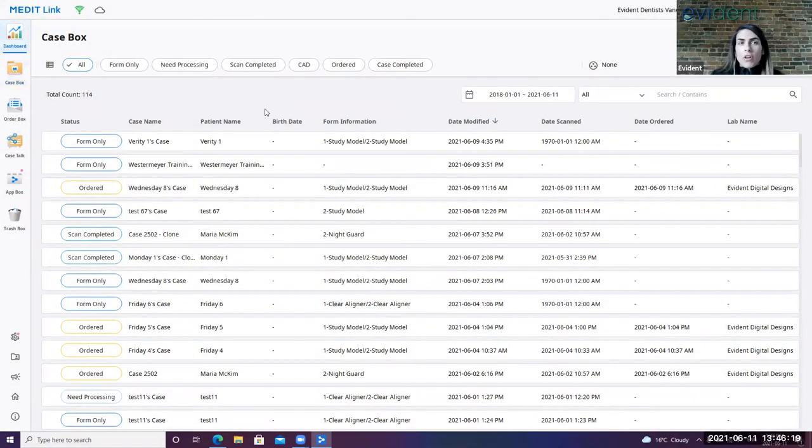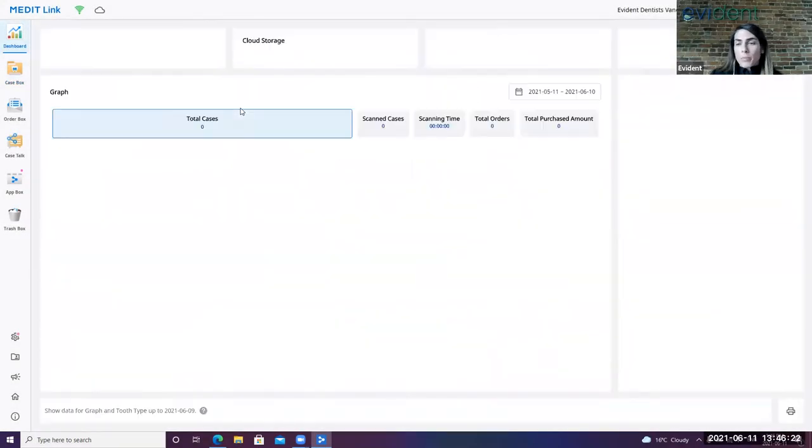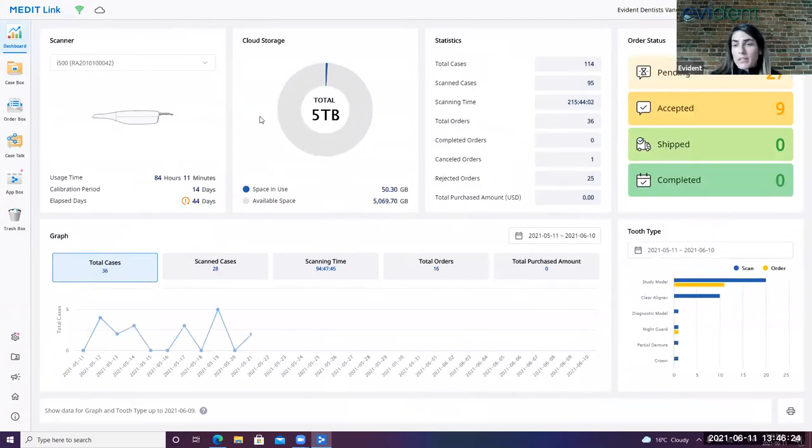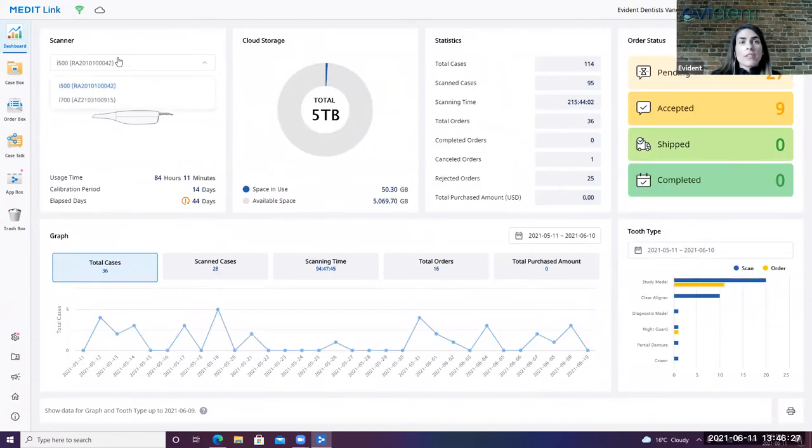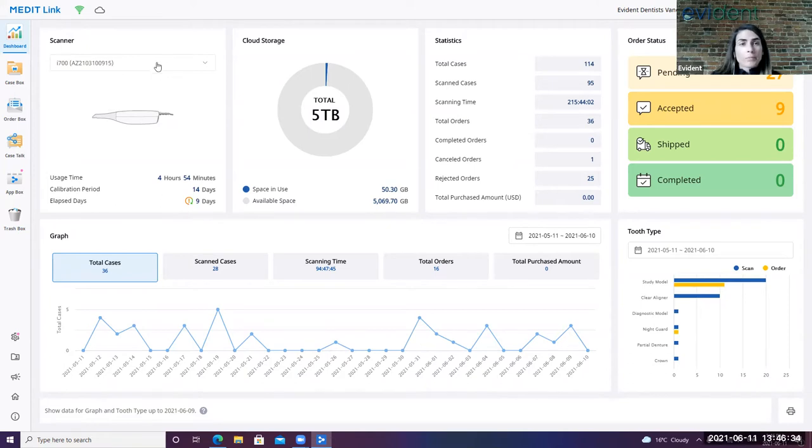So basically, this is a MediLink software. They have done a few upgrades since the 700 was released in that mid-April period. As you can see here in our scanners, we have both the 500 and the 700 registered. I'm going to select the 700 because this is the one I'll be demoing today.